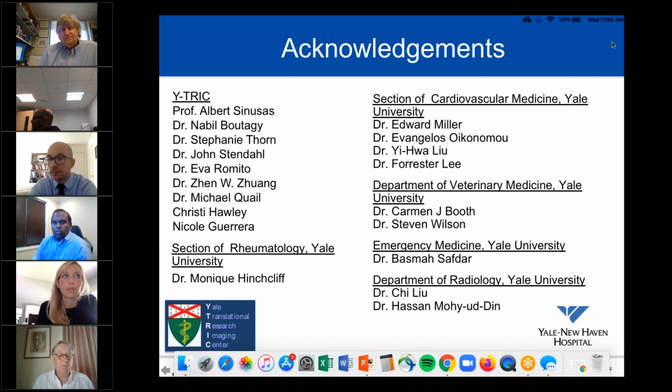Well, it's very difficult to say. Each technique has an error. For instance, if you measure ejection fraction, anything below 5 percentage points of ejection fraction should not be considered significant. The same goes for flow. You have variability. My only suggestion is to match the PET data with the clinical data. If you see that the patient after transplant is getting worse, is getting angina more frequent or more severe, and you see at the same time a progressive reduction of flow and flow reserve, this is where all this makes sense.